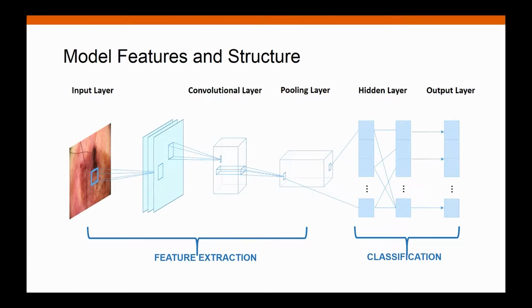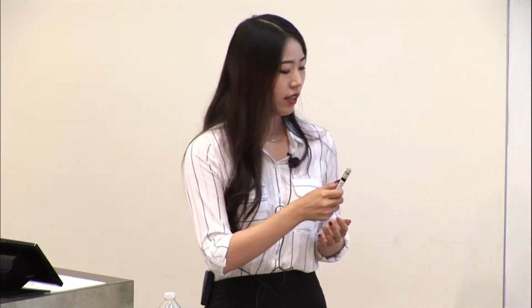So it's actually also a kind of transfer learning, because the original architecture was trained on the ImageNet database. And ImageNet, I'm sure you are pretty familiar with, is trained on over millions of images and over 1,000 normal life objects. And here we transfer learning into the skin disease domain.